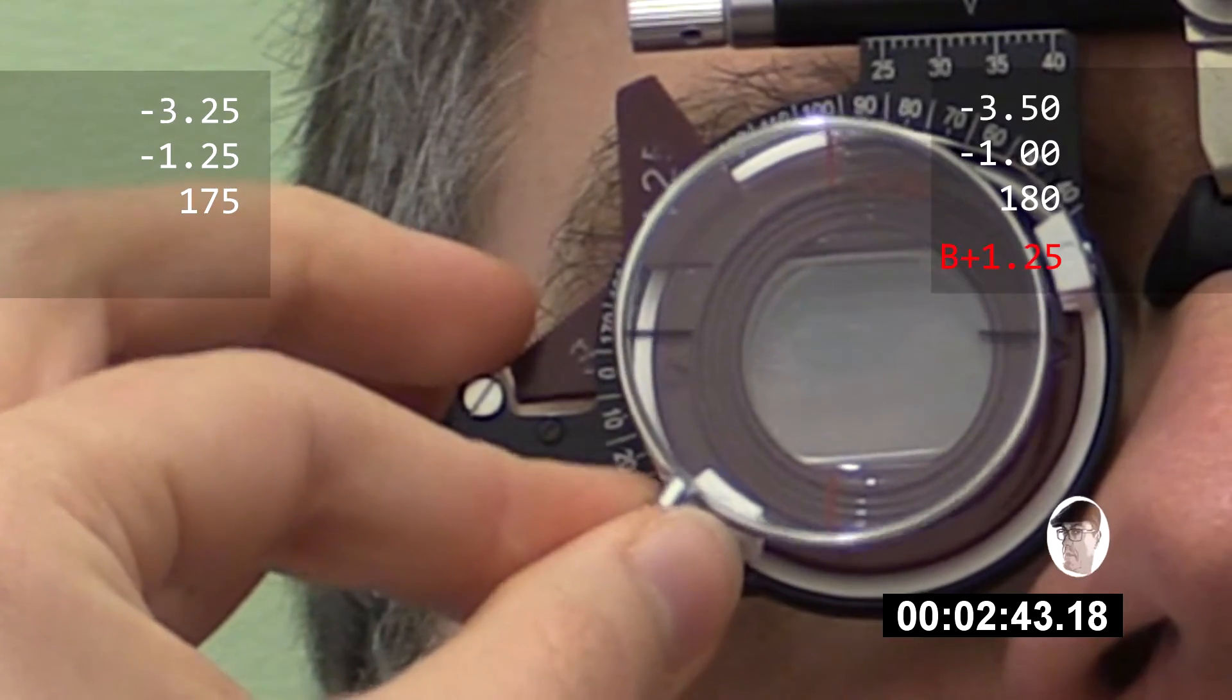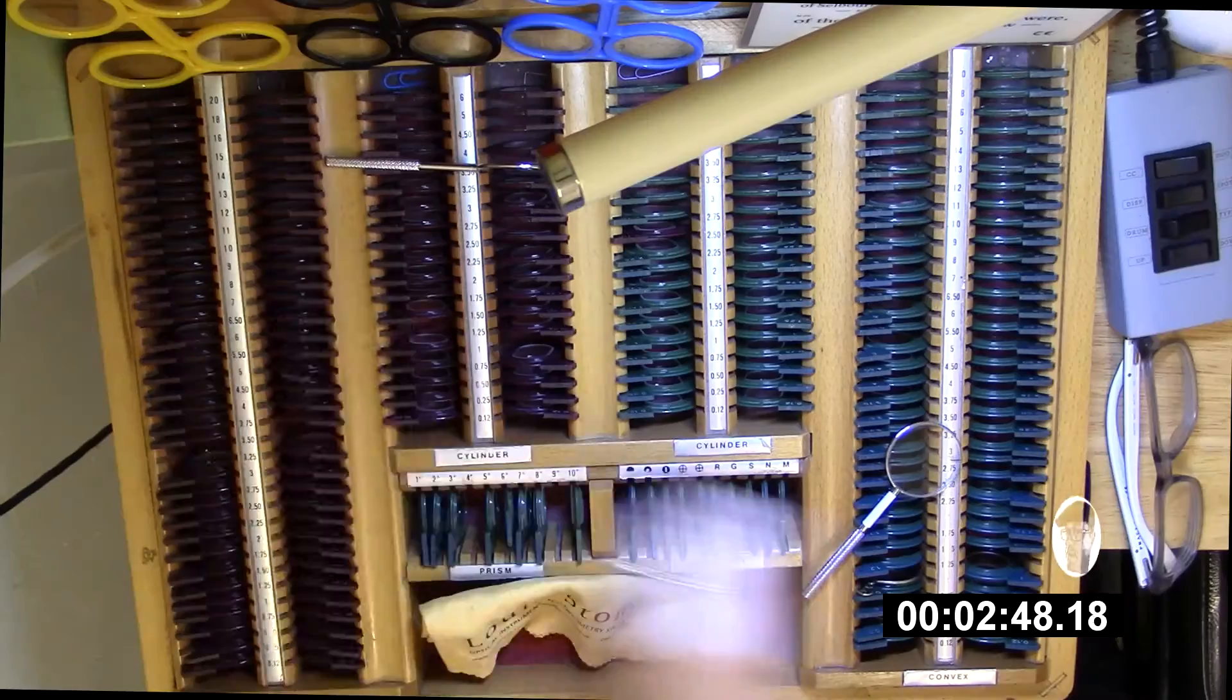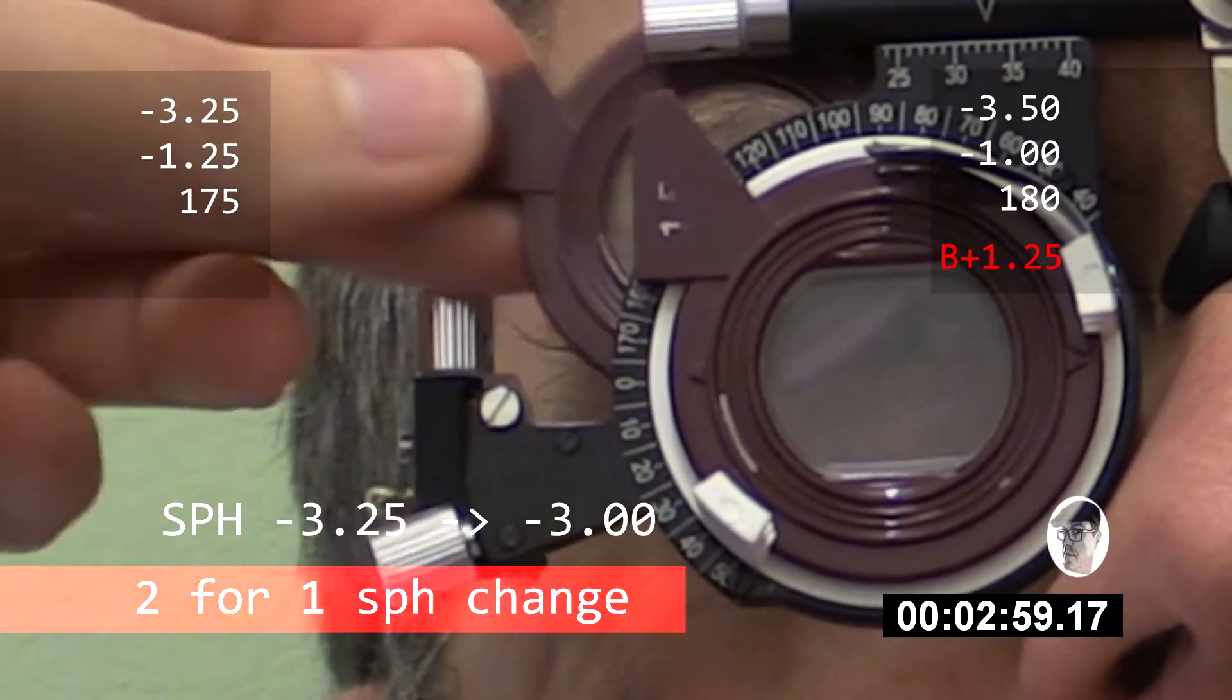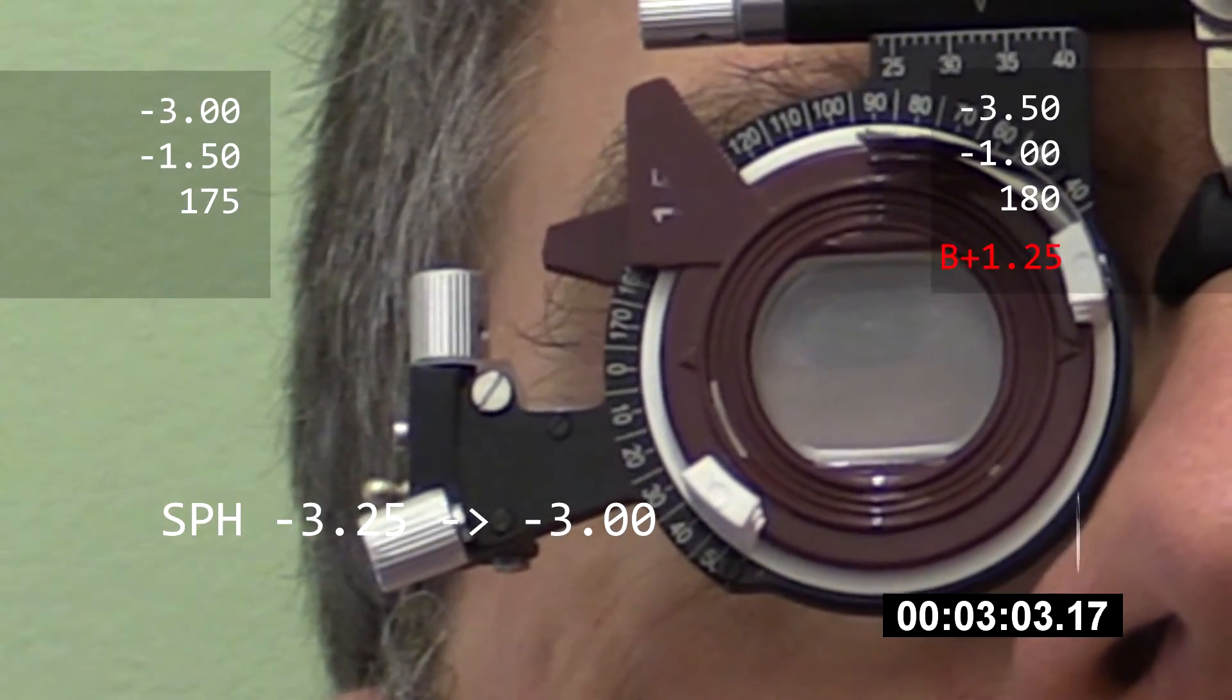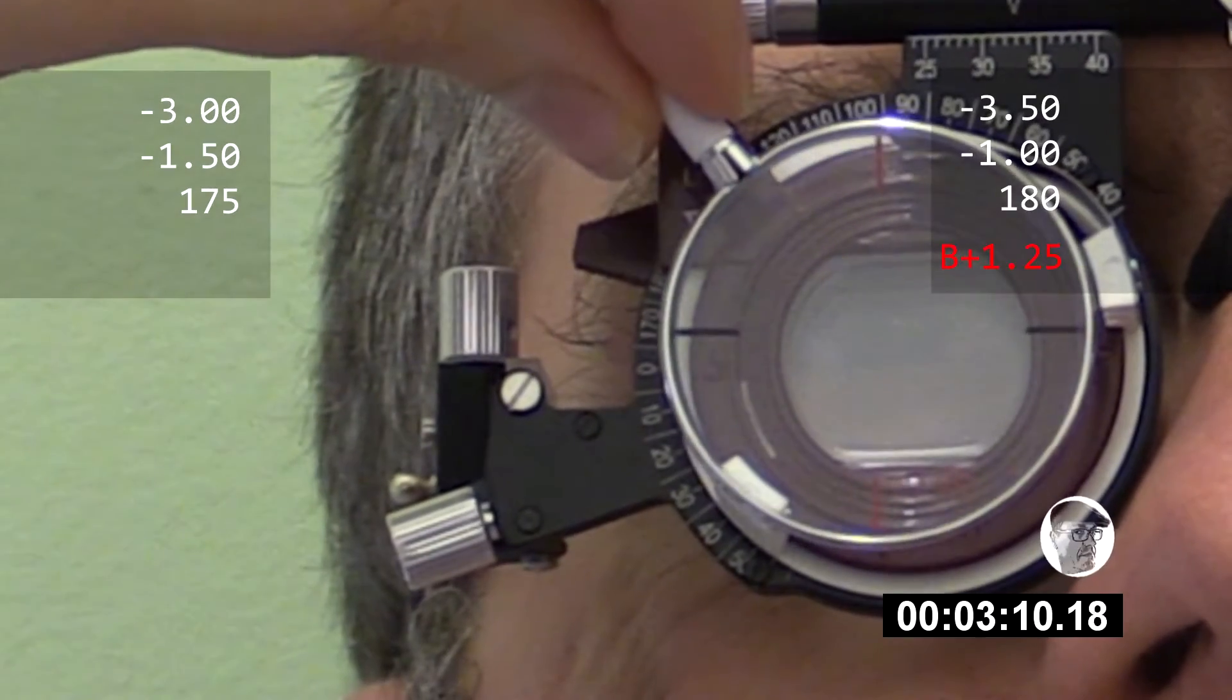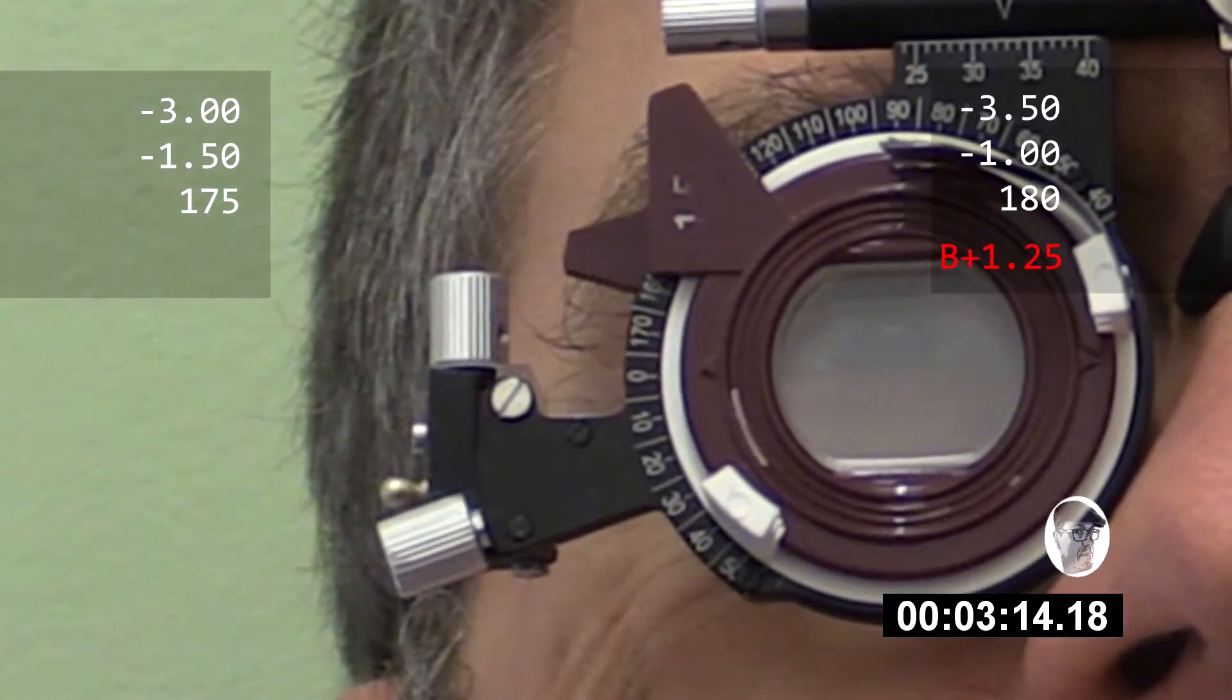Four. And three, four, four, four. And four. Four. Four, again. Yeah. Three, four, four, where do I have this one? I'm not sure. That's three and that's four. Very similar. Yeah. Okay.